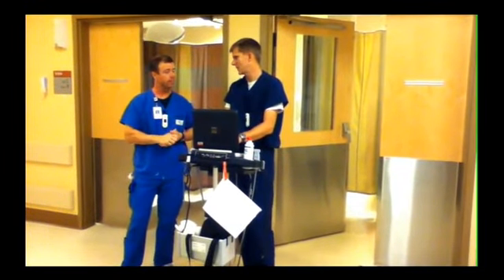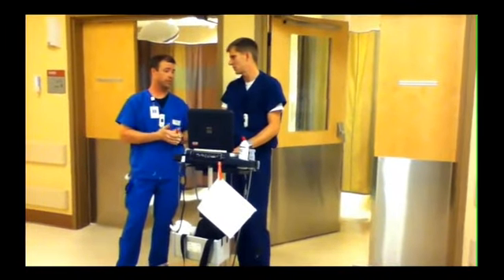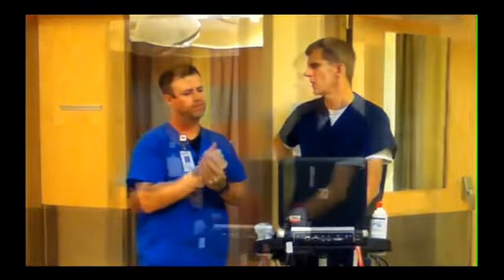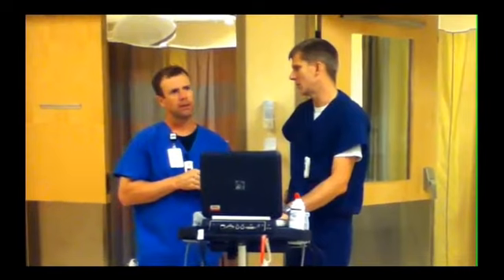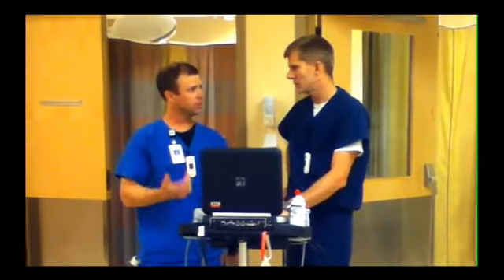I was noticing that a lot of nurses know how to put in IVs, but a lot of nurses don't know how to put in IVs with ultrasound. That's funny, because a lot of physicians know how to place ultrasound-guided IVs, but they have no clue how to put them in without an ultrasound. It would be good to have a tutorial on placing an IV both with and without an ultrasound.